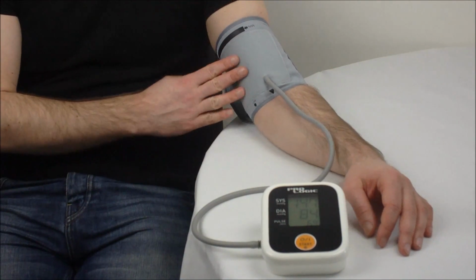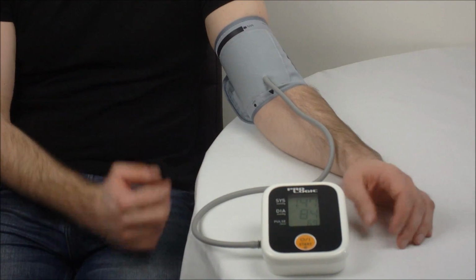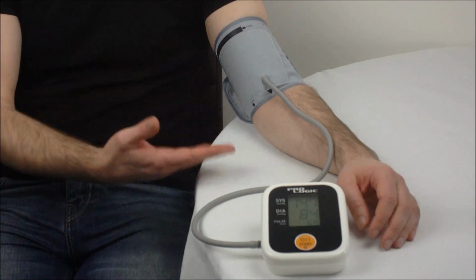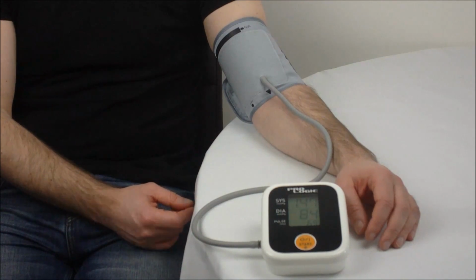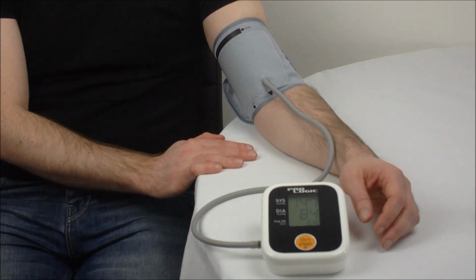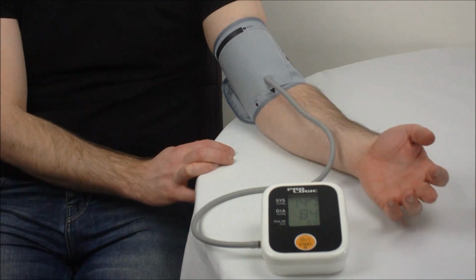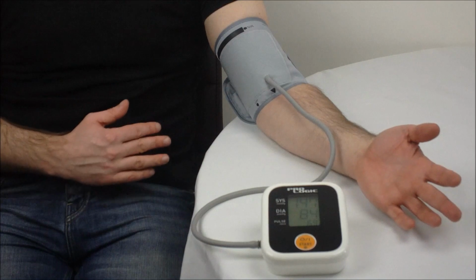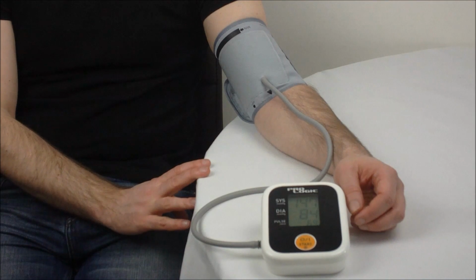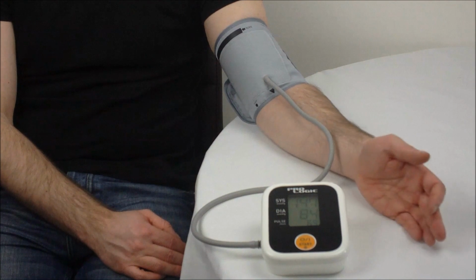Now when you take your blood pressure, it's really important that you do it under the same conditions, so time of day will affect your blood pressure. So if you want to measure your blood pressure in the morning, make sure you carry on measuring your blood pressure in the morning. Changing arms will affect your blood pressure, so make sure you stick with the same arm. Even things down to eating a meal or having a caffeinated beverage, be it coffee or cola or tea. Even down to having a full bladder can affect your blood pressure. So it's important that you measure your blood pressure under the same conditions each time you do it if you're going to compare accurately between different readings.